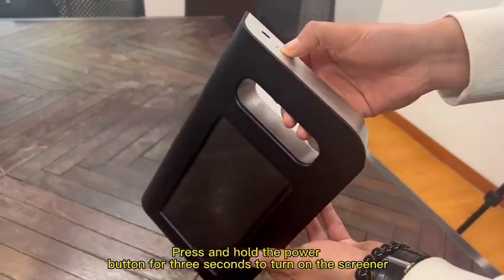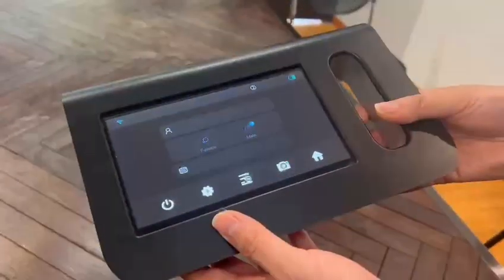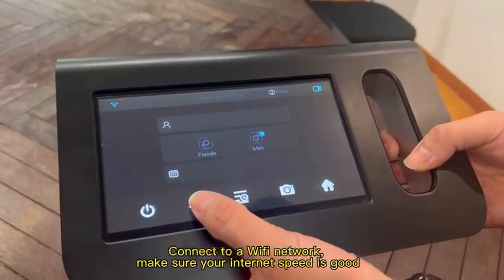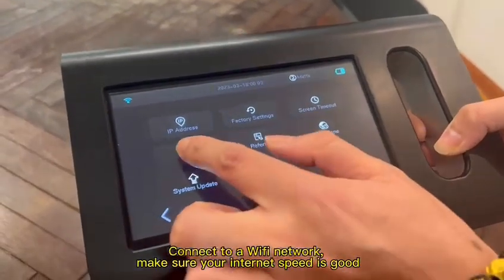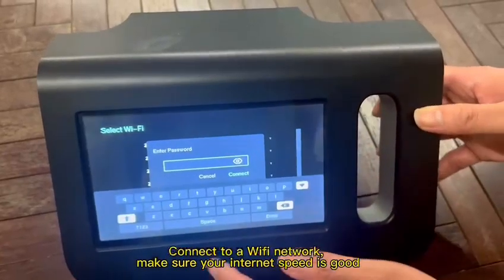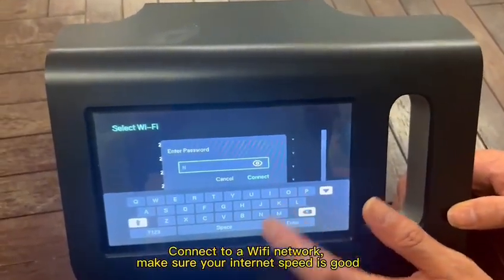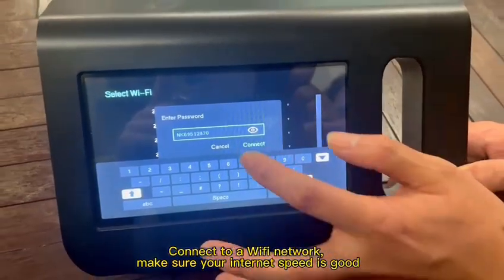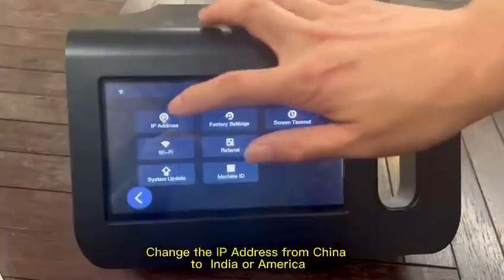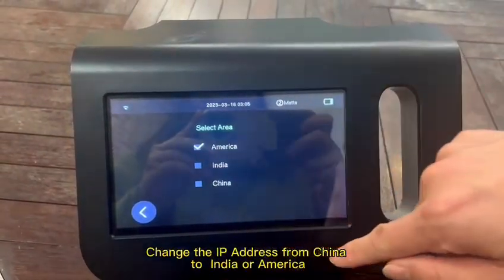Press and hold the power button for 3 seconds to turn on the screener. Connect to a Wi-Fi network and make sure your internet speed is good. Change the IP address from China to India or America.